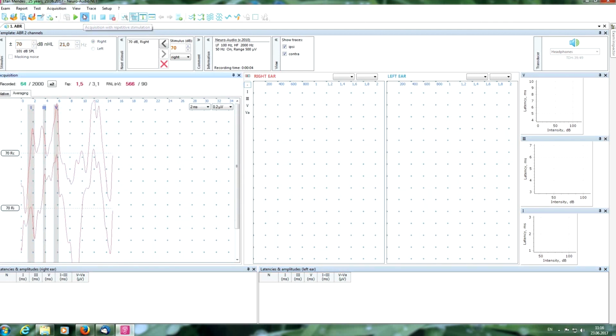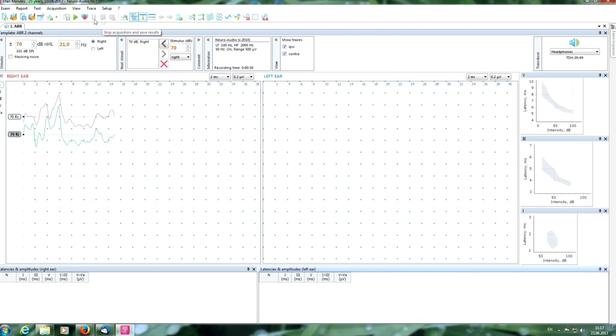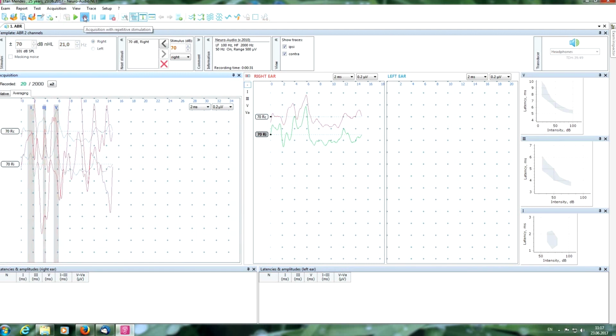Now you can see the stimulation and averaging process. Also, you can see the gray bands of normal values for latencies of the main peaks. Here you can see statistical parameters, which allow us to estimate if we get a reliable response. We can stop the acquisition if we have a good response, and start the second cycle of stimulation to check the reproducibility of responses.